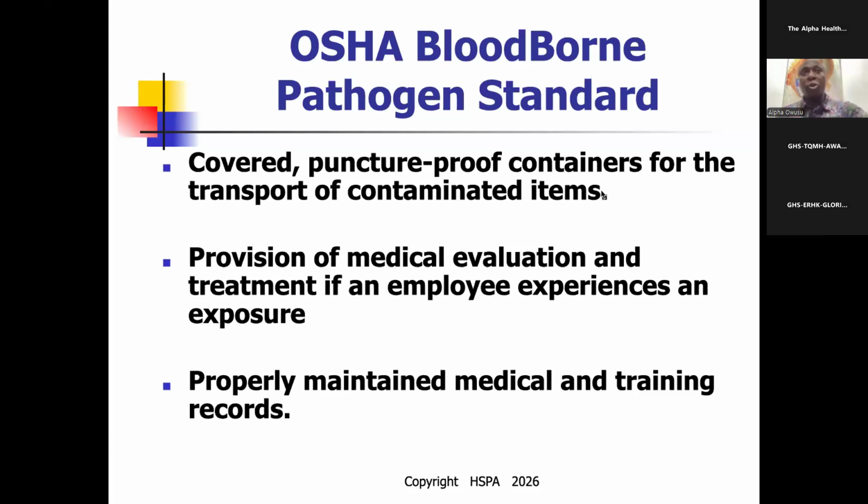The tray, who processed the tray? Alpha processed the tray. Each sterile processing technician should have a unique ID. You scan your tray, you get your tray scanned in the system. You know that Alpha did the cleaning in decon. It went to sterilizer number 2. When it came from sterilizer number 2, it went to workstation 2.